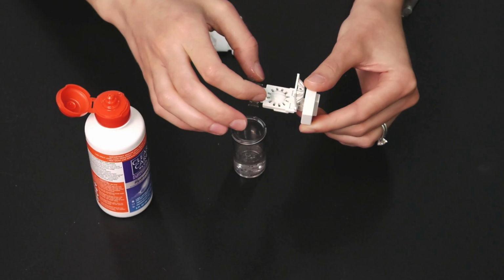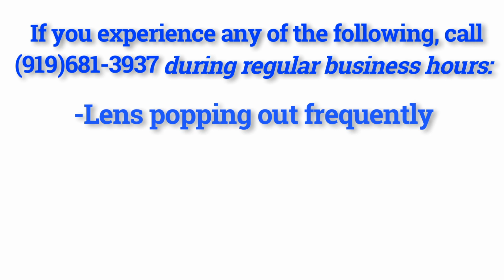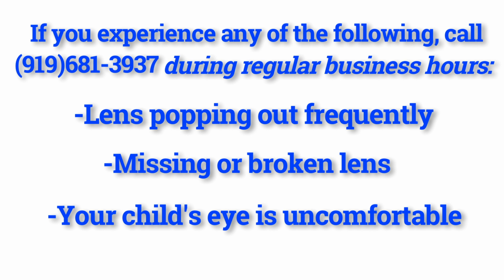into your eye. If you are experiencing any of the following issues, please call us during regular clinical hours. If the contact lens is popping out frequently, if your contact lens is lost or broken, or if your child is uncomfortable with the contact lens, please remove it and give us a call when we are open.